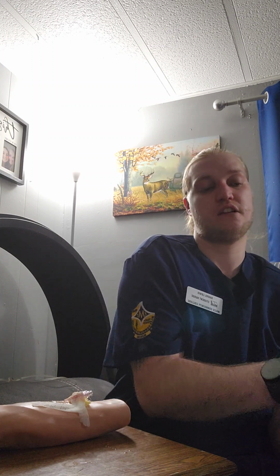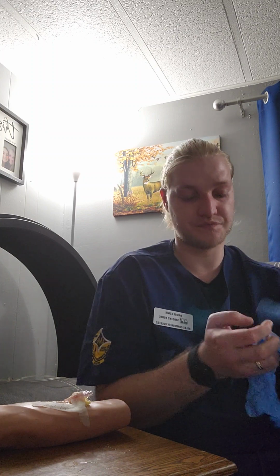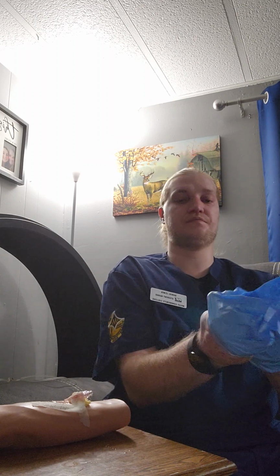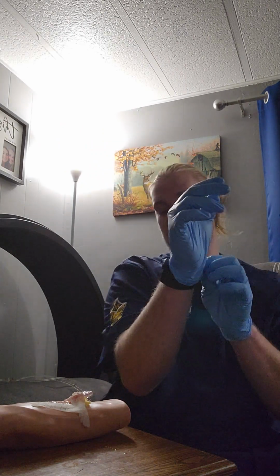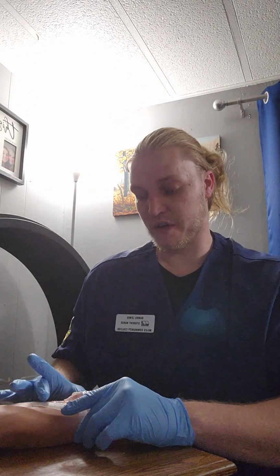So at this point, the patient's done, he's about to go home, he's going to be discharged. So again, I would go to the room, introduce myself, perform hand hygiene. For this, all I need is gloves, gauze, and tape. So I'm going to go ahead and put my gloves on.